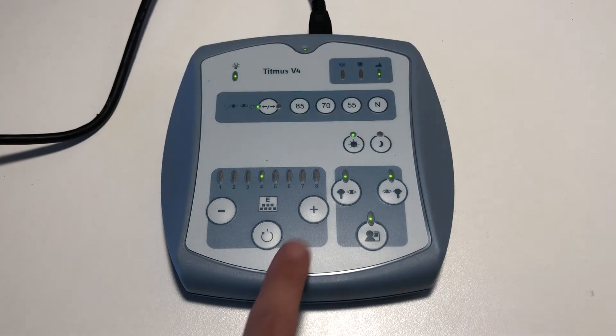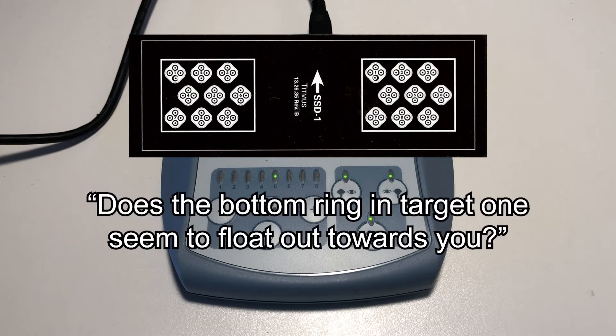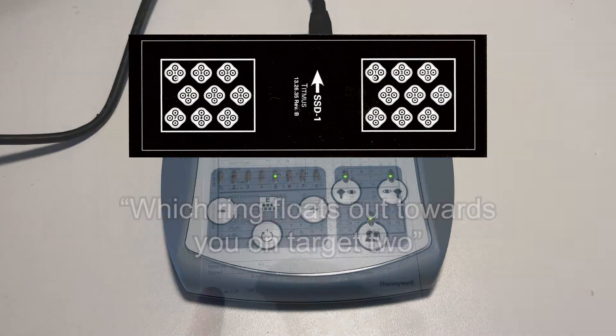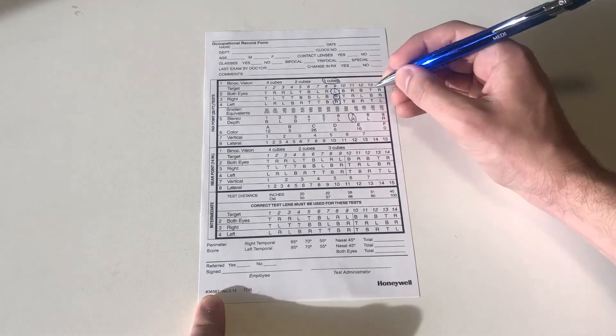Advance to slide number 5. This slide tests for depth perception. When the patient sees the combined image, one of the rings in each target should seem to float. Ask the patient: does the bottom ring in target 1 seem to float out towards you? If no, move on to slide number 6. If yes, say to the patient: tell me which ring floats out towards you in target 2. Repeat for all 9 targets and record the last correct answer given by the patient.